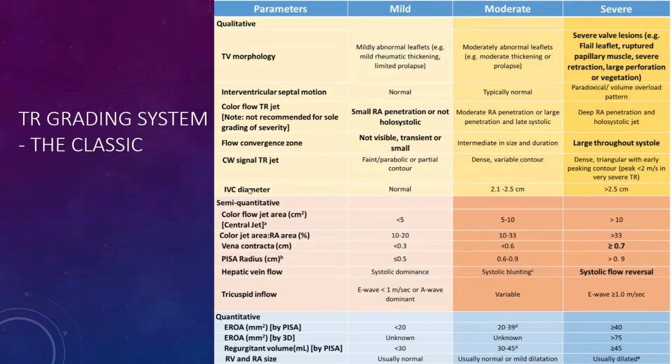And various different features of the valve were incorporated, like the ESC guidelines as we go through. The various features that were incorporated are still relevant now, although the grading system has changed. So I'll talk a little bit about some of these things.